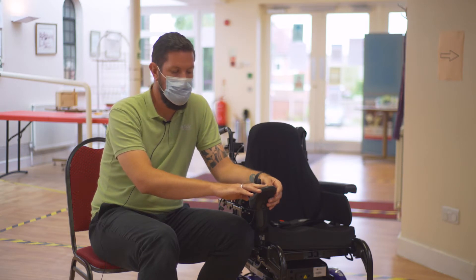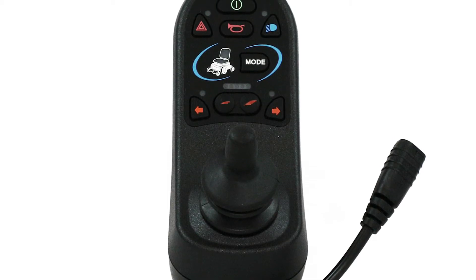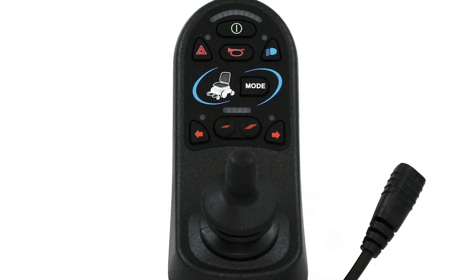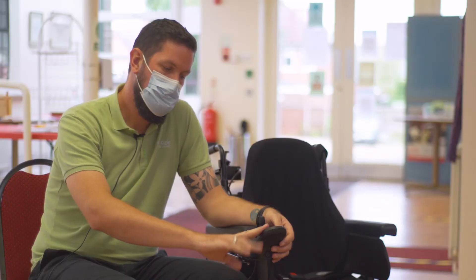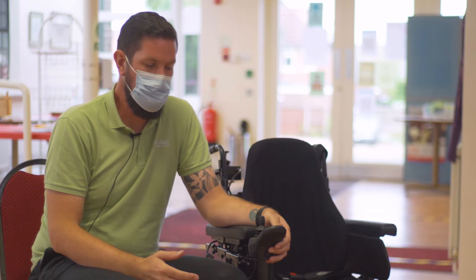We have the on/off switch, we have a horn, we have a mode button, and we have two buttons that control the different types of speeds or settings within your actual remote itself. You'll hear me call it a remote — it could be called a controller, a remote control, all different types of names — but primarily it's just the thing that drives your chair.